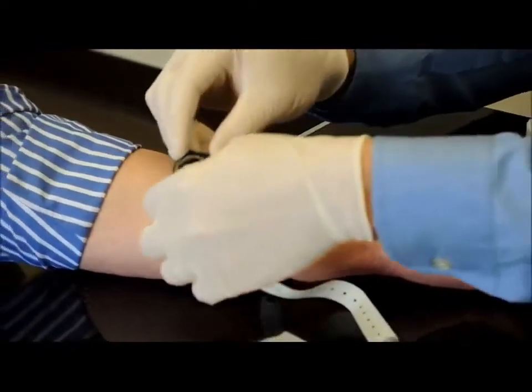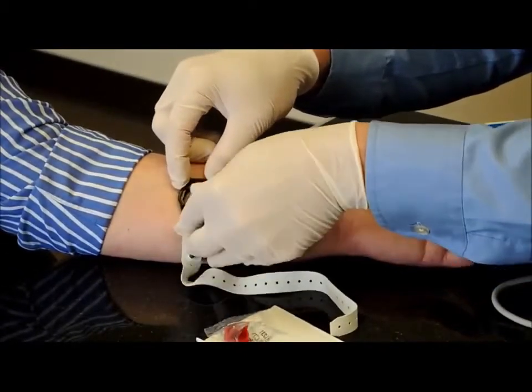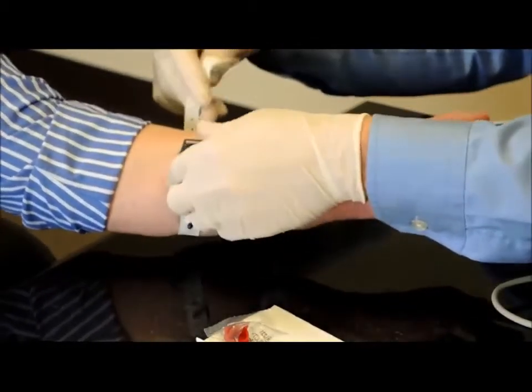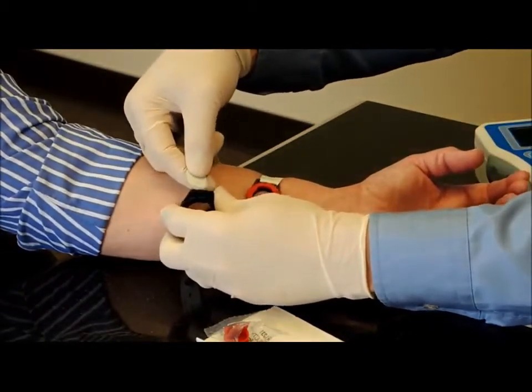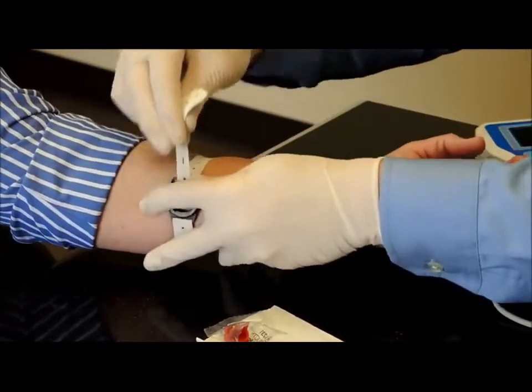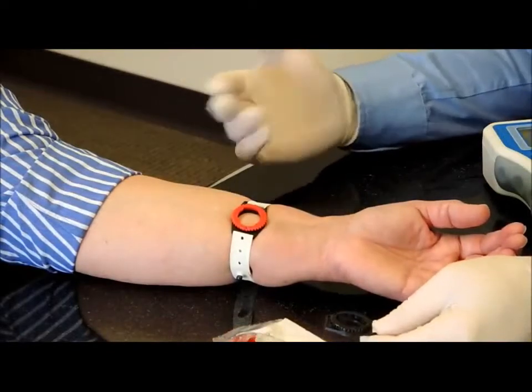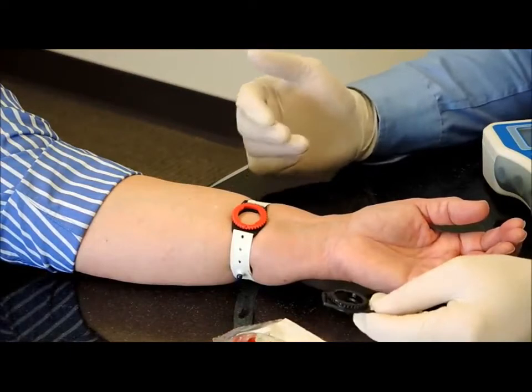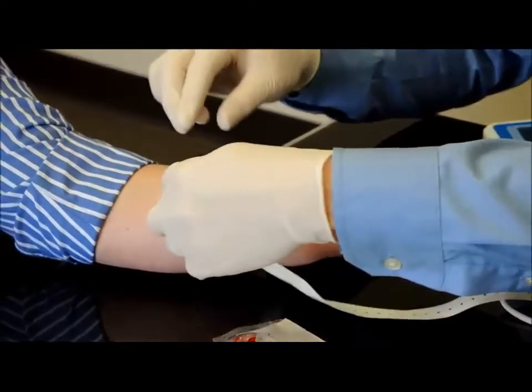So we'll also attach the black holder. The black holder should be an inch or so away. It doesn't really matter how far away it is from the red electrode. Usually I go up the arm, not closer to the wrist, to stay away from any tendons. So, as you probably observed, when I first tried to do the black strap, the strap was too small, so we had to go to the larger strap to fit the arm better.